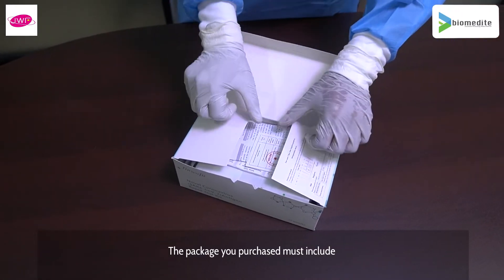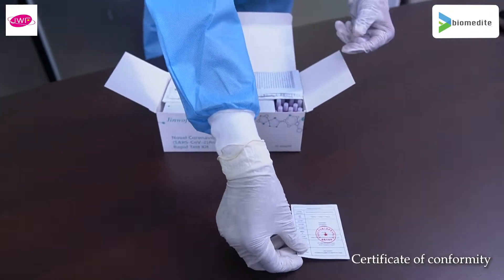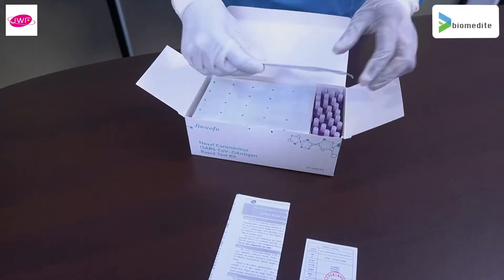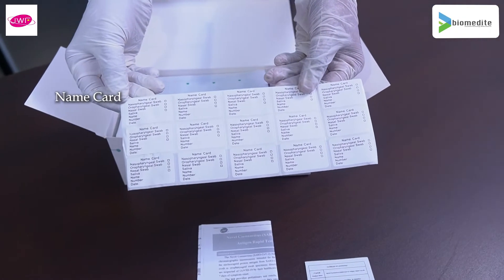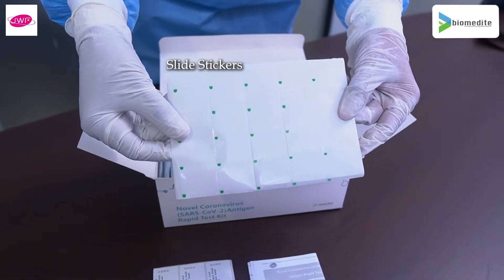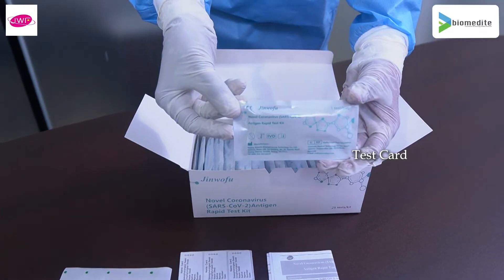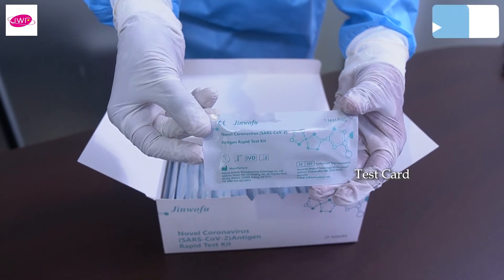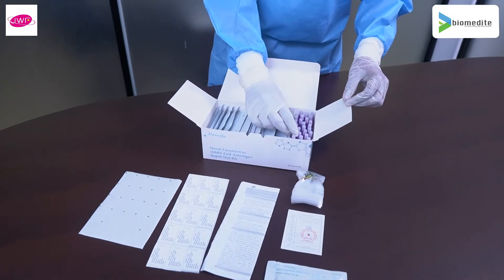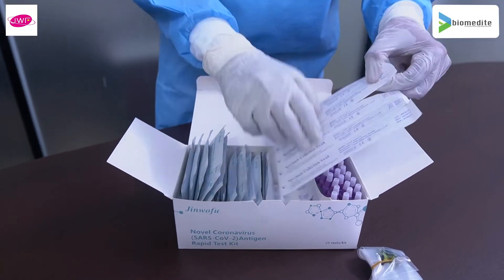The package you purchase must include a certificate of conformity, introduction manual, name card, slide stickers, test card, biosafety bags, sampling tubes, and a nasopharyngeal swab.